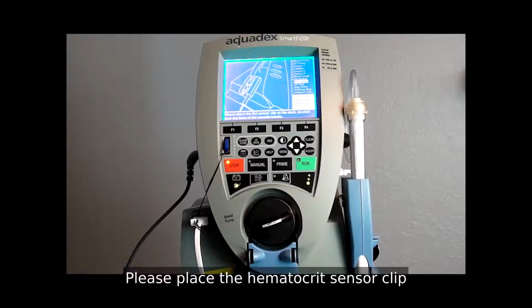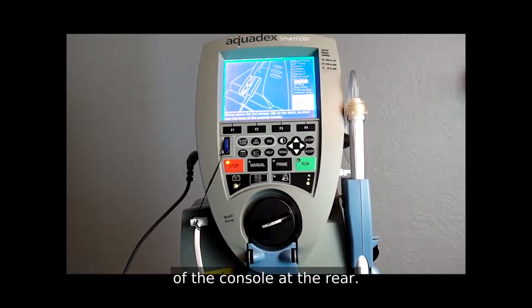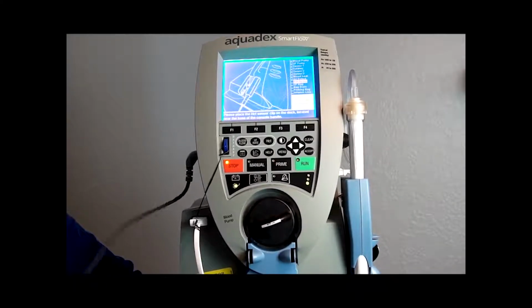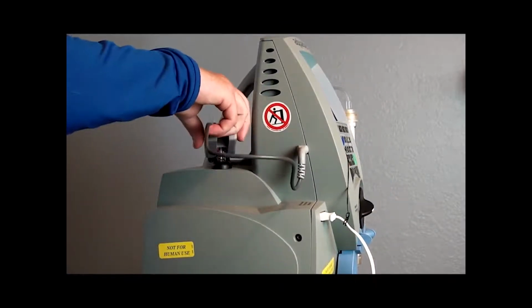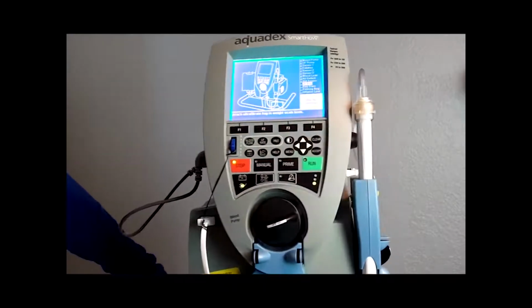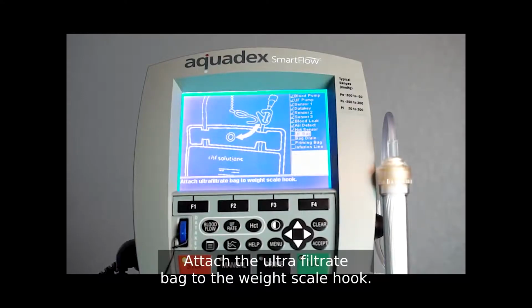Please place the hematocrit sensor clip on the dock located near the base of the console at the rear. Attach the ultrafiltrate bag to the weight scale hook.